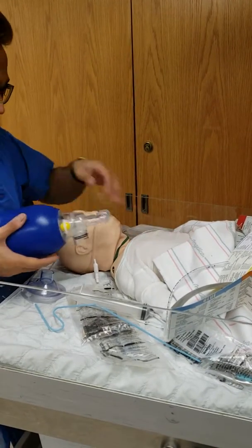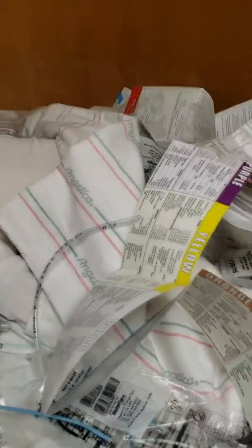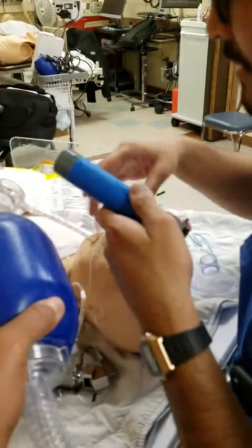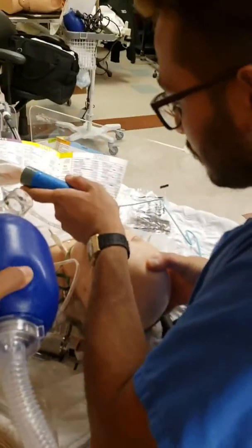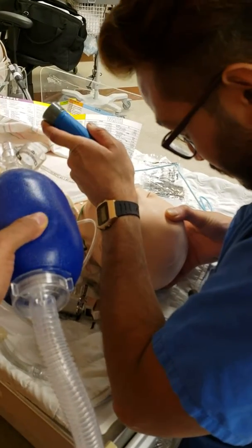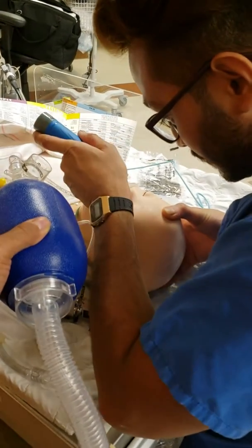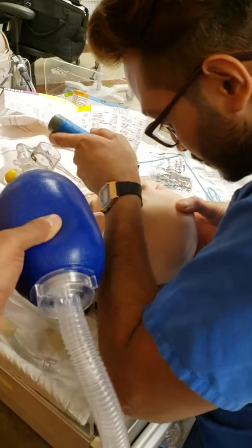Verify placement. Take it to the left — someone will be holding. I think I have an esophagus. Remember, you have to lift up the glottis to make sure it's in. Is it in?